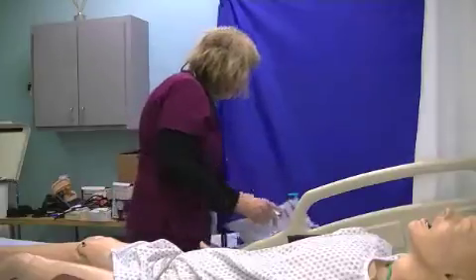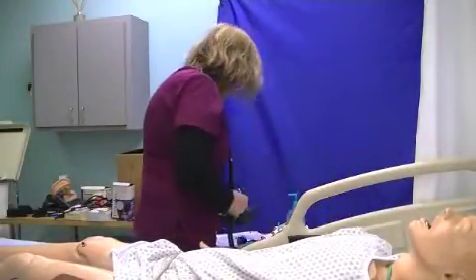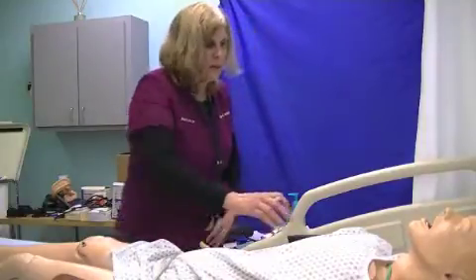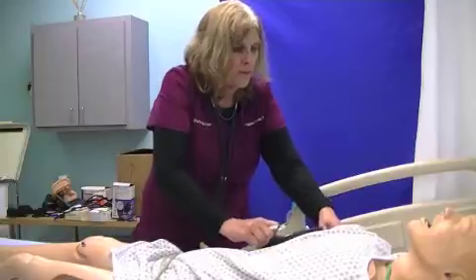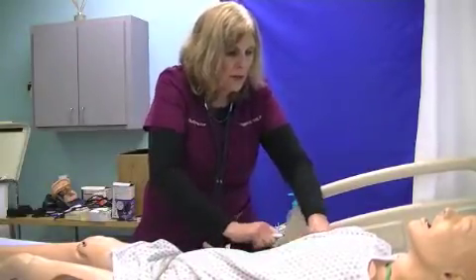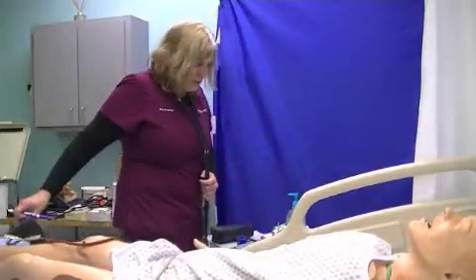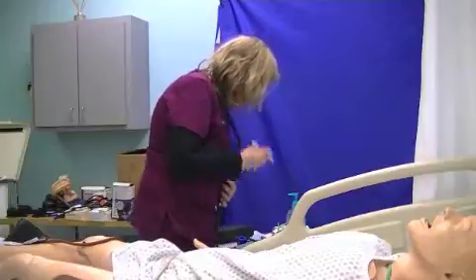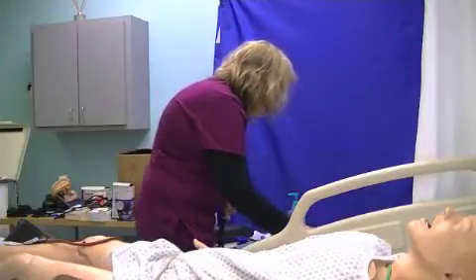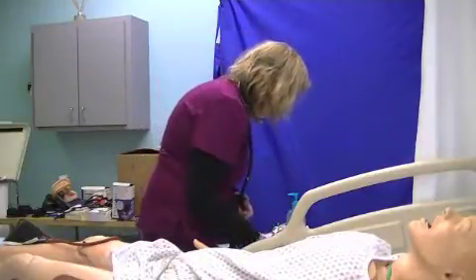If I didn't get the reading right away, I'm going to make sure that I wait 2 minutes in between readings before I pull it up. I'm going to make sure I take this off their arm, because I've seen people with blood pressure cuffs stay on too long, and it caused their arm to turn blue. Okay, so I'm going to make sure I take that off. The reason we wait 2 minutes in between readings is because we allow the vessels to return back to normal.